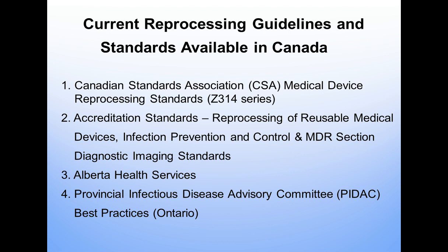So if you don't have all three of those, I would suggest it would be very important for you to have a copy and to review that and to ensure that you're meeting all of those. I know most of the larger health authorities in Canada do have accreditation processes occurring in their facilities every 3 to 4 years, and so it's important that you stay on top of those. Alberta Health Services has a provincial guidelines document that's available online, and so does Ontario.